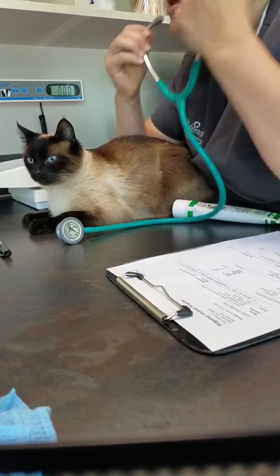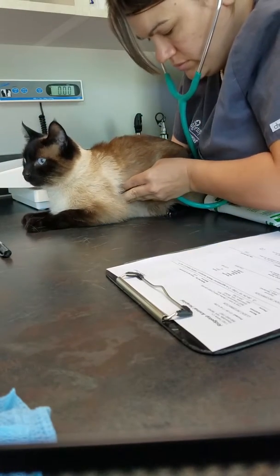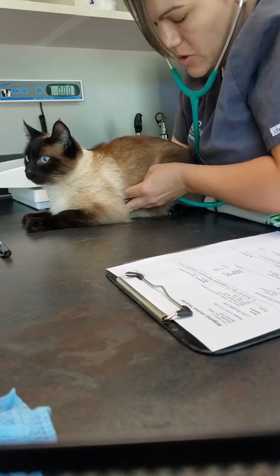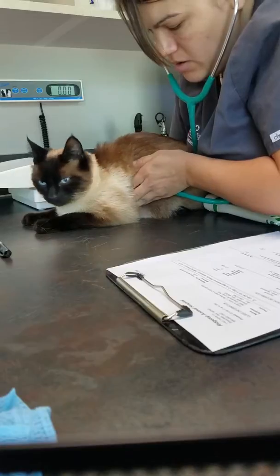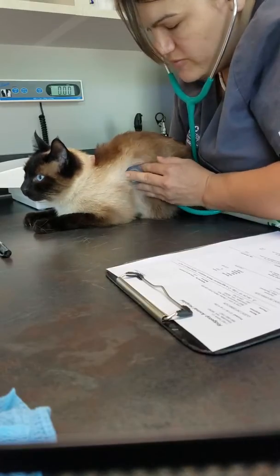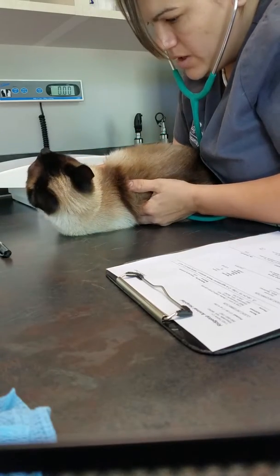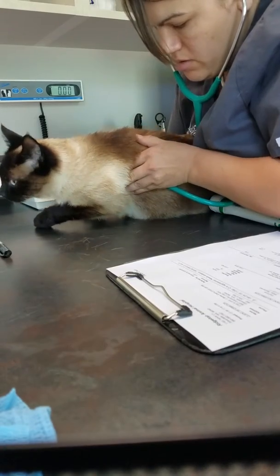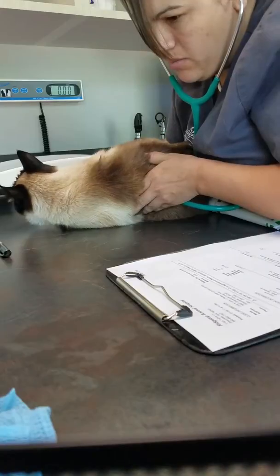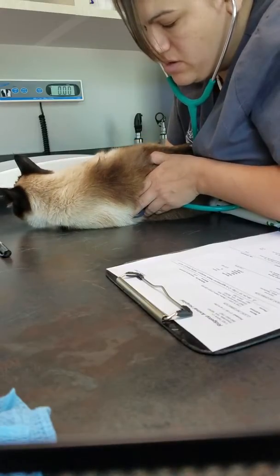So we can go ahead and listen to the heart. So this is my pulmonary artery, pulmonary valve, and then you can move to the aortic, and then you can move to the mitral and listen for any abnormal heart sounds such as murmurs or arrhythmias.